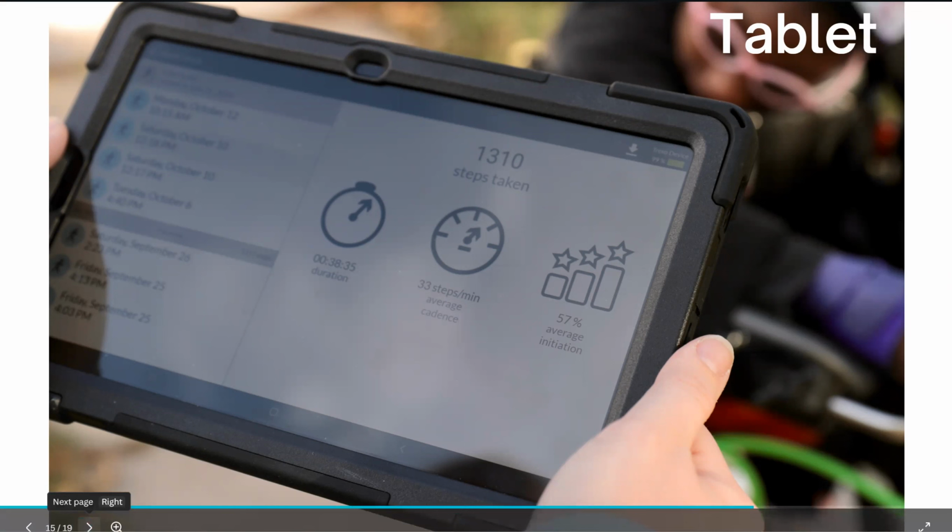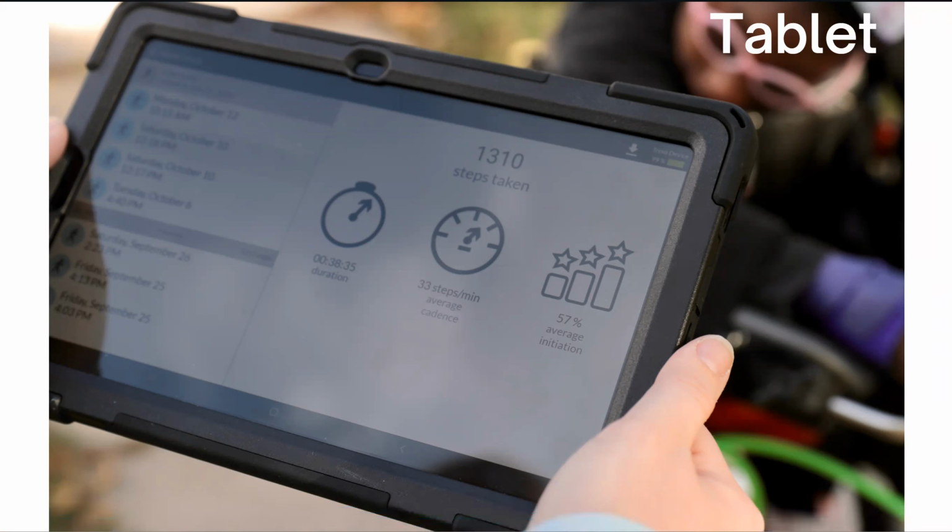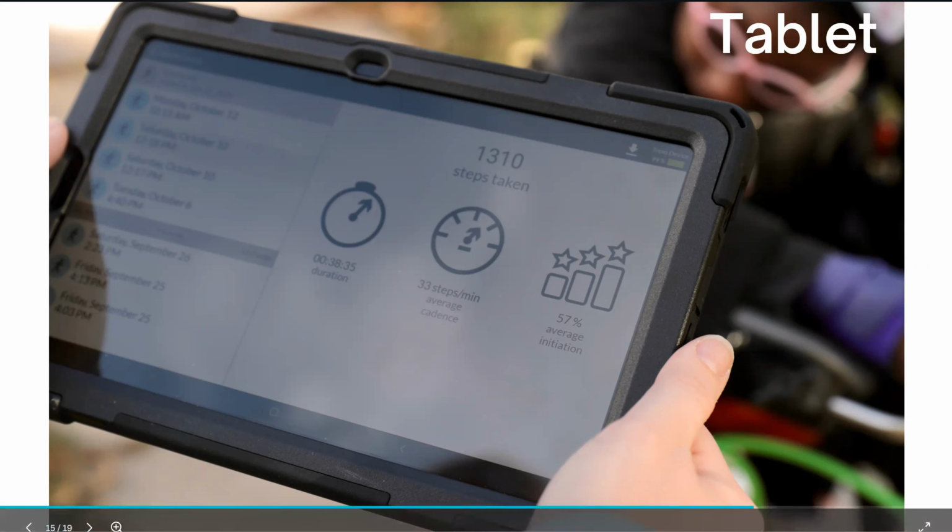And the other thing I'll just mention real quickly is when we create new modes or new features or things like that, the updates are pushed out through the tablet. So it is easy for you guys to stay current on the most recent features.